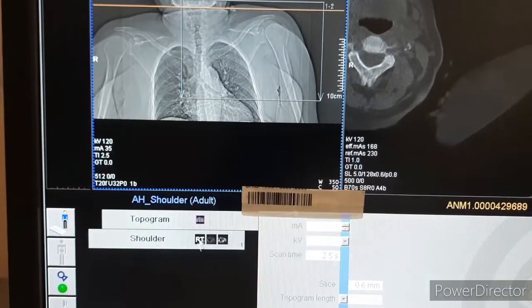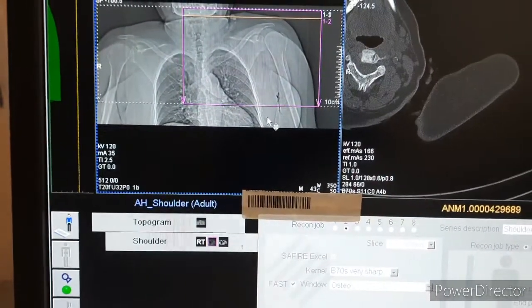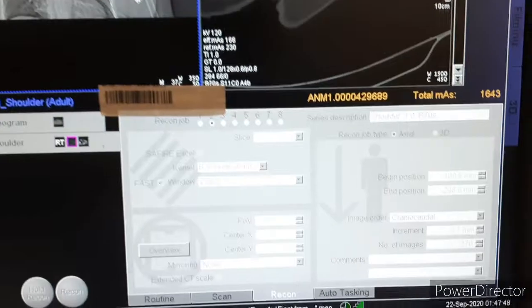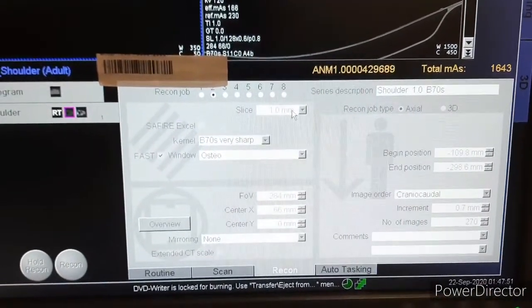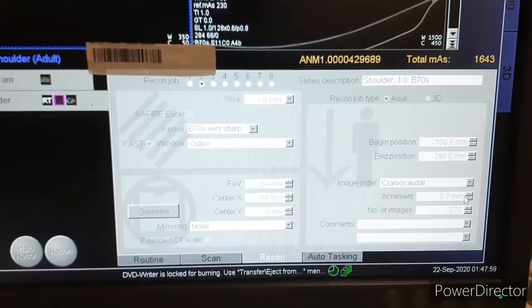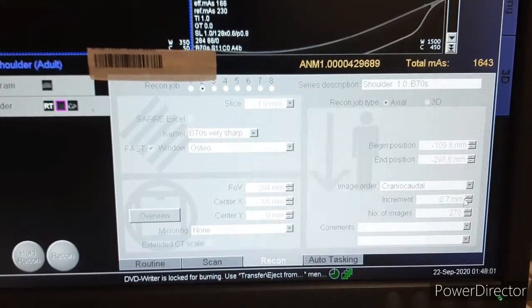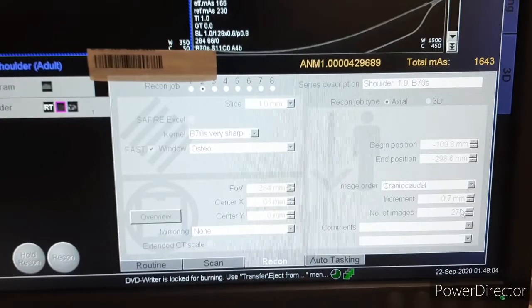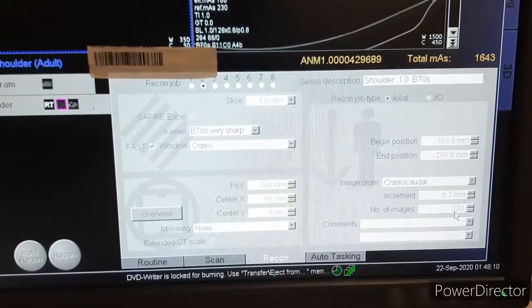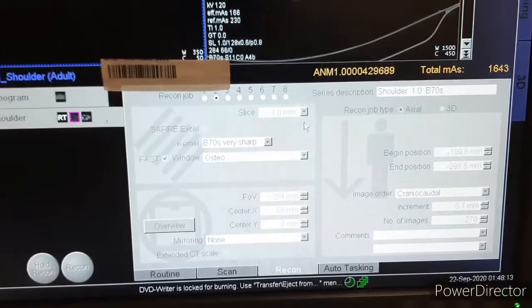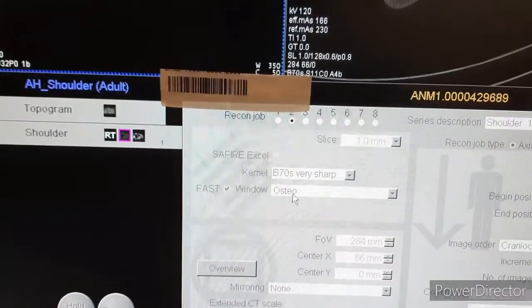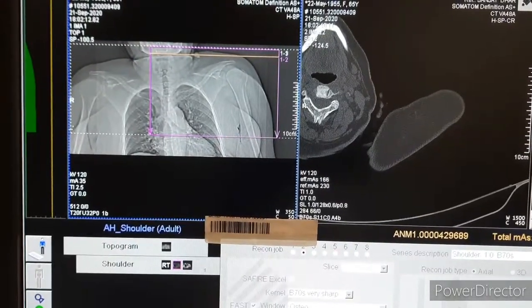After taking the scanogram, you have to acquire the scan at 1 millimeter slice thickness. The gap is 0.7 millimeters — you can keep it at 1 millimeter depending on your machine. With a 0.7 millimeter increment, you will get approximately 270 images. For bone window, we have used filter B70.